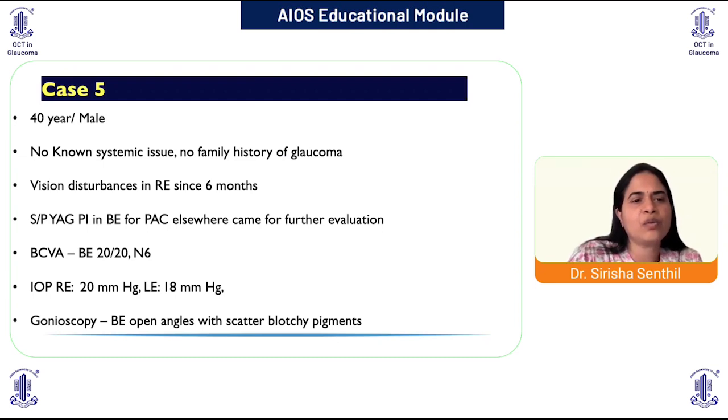Another gentleman, a young patient who was referred to us, an angle closure patient who underwent a YAG peripheral iridotomy earlier, and his intraocular pressure were in the normal range. His visual acuity was also quite good.